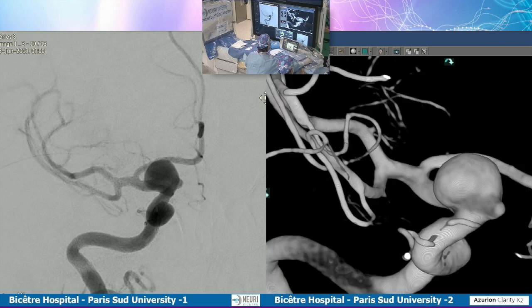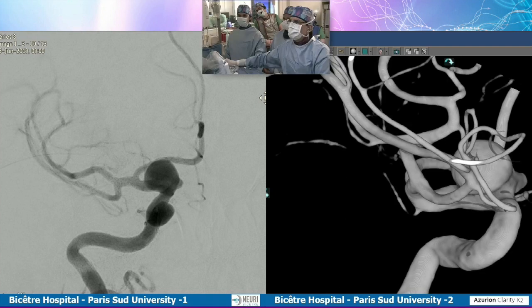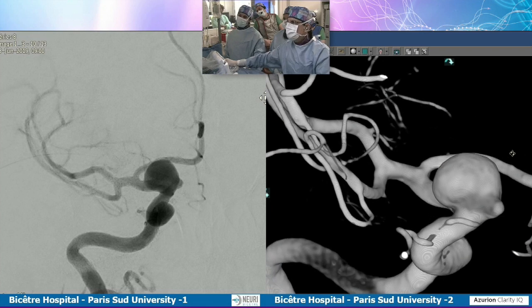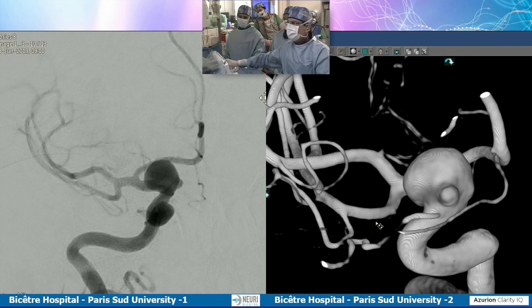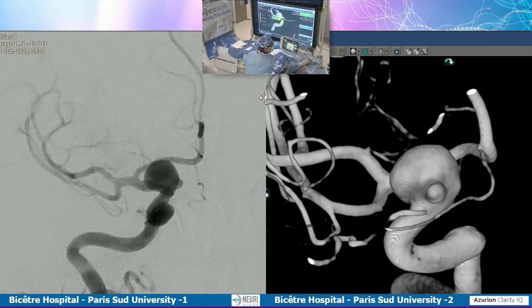The first one will be that one, just to cross the neck of the aneurysm. We'll be using the 3D roadmap. And the second one will be that one, just to clearly view the M1 segment and especially the MCA bifurcation. So the measurement of the aneurysm is roughly 9 millimeters, so we don't plan to put any coils inside. As you can see on this aneurysm, there is a small daughter sac here. So we did the 3D roadmap and transferred it automatically. We have sent it automatically to the LINNC software directly, so probably you can see it on screen.